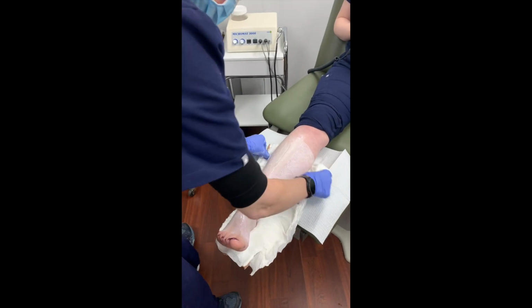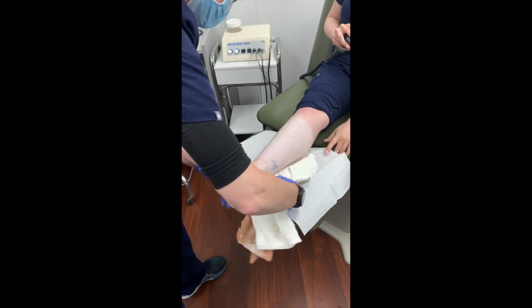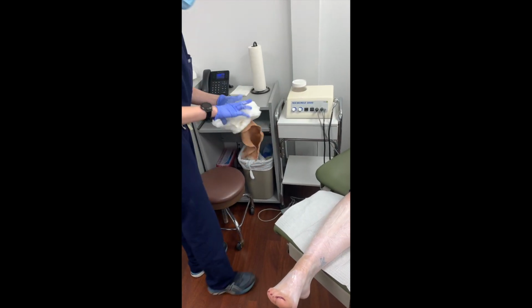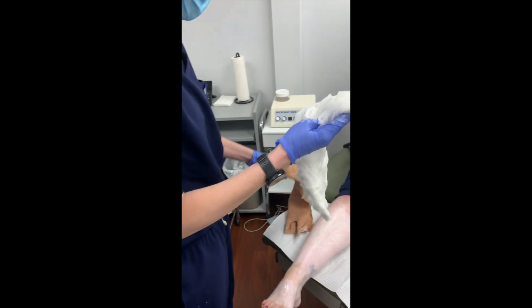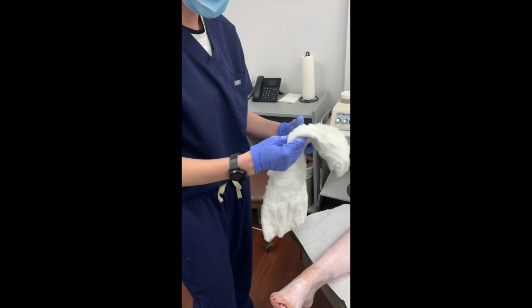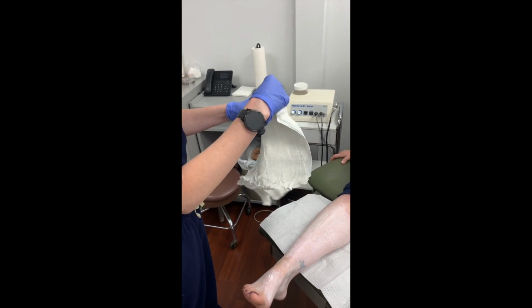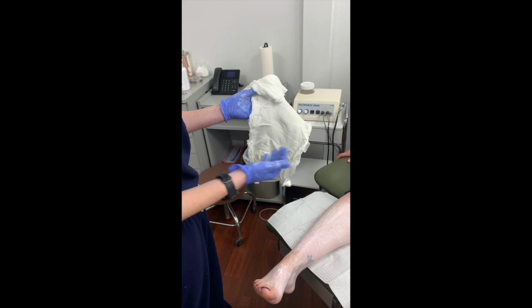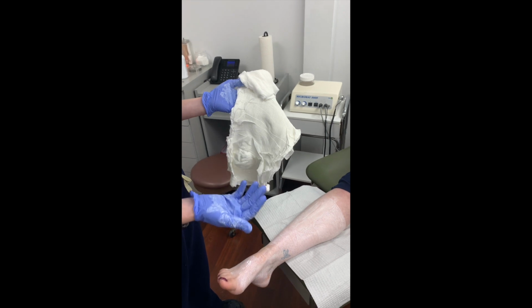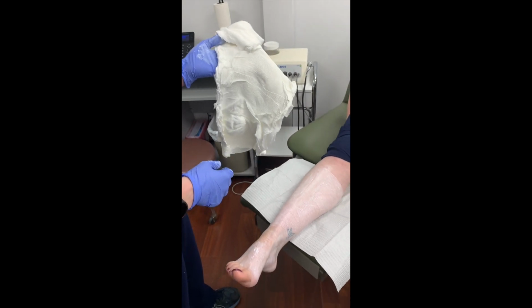Peel the layers off. This would not be quite as pasty because it'll have been dried and been on for a few days, but that paste is normal. And toss the dressing. If there's any dressing issues, or if the patient is a heavy exudator in terms of venous wounds or chronic weepage, some providers prefer to see the dressing to see what type of drainage is there. If it has a greenish color, you'd be concerned about some pseudomonas. If there's bloody drainage, different drainage patterns can help the provider with the appropriate diagnosis and treatment protocol.